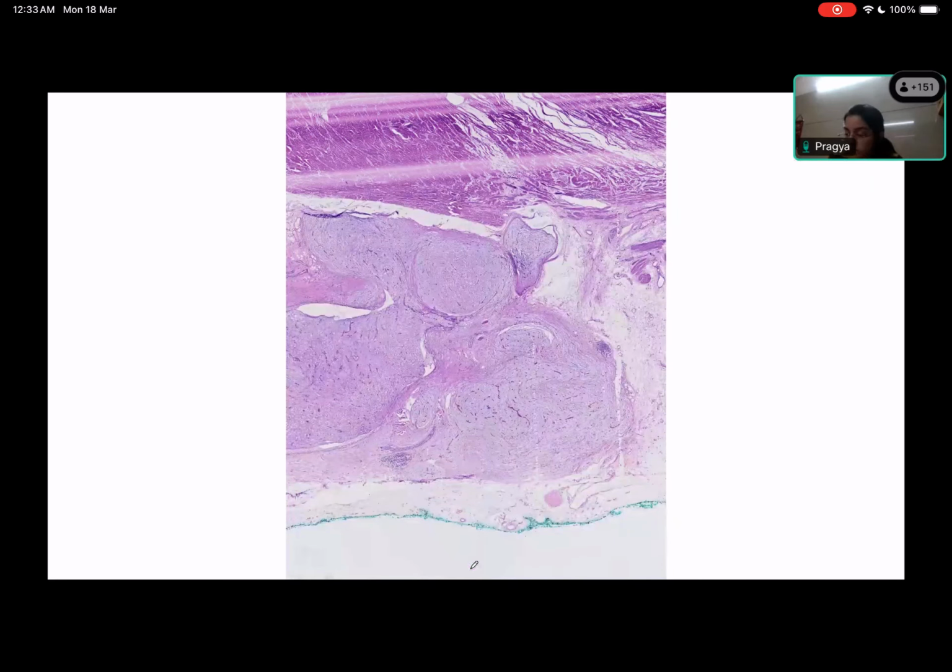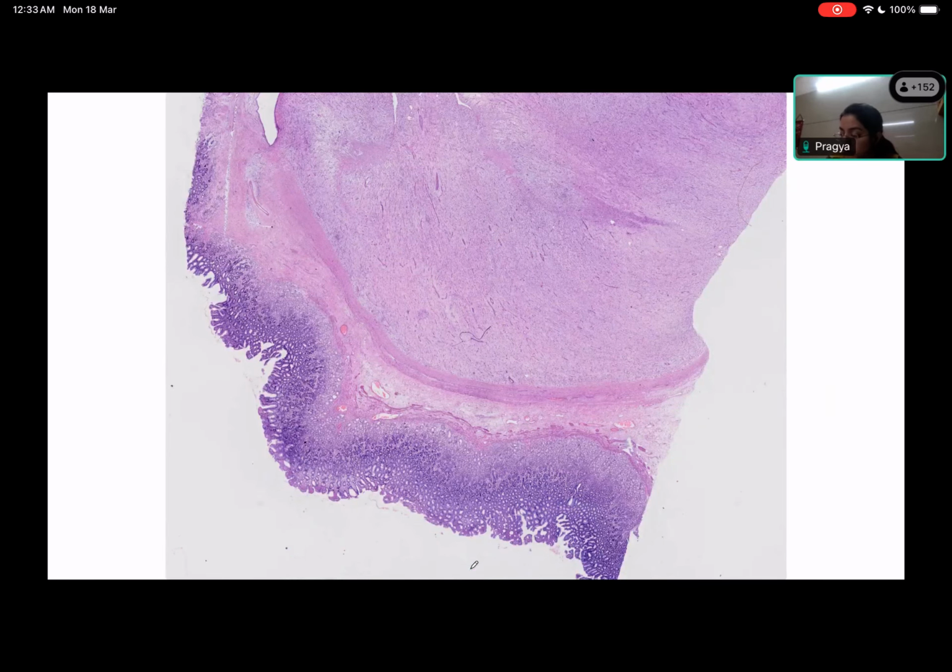Yes, ma'am. Gastric biopsy shows a well-circumscribed tumor which is present in the submucosa, arranged in lobules, with individual tumor cells having spindle-shaped wavy nuclei with fine nucleochromatin, moderate cytoplasm with ill-defined cytoplasmic boundaries. Prominent myxoid change noted, and there's no significant nuclear atypia or mitosis. Correct.